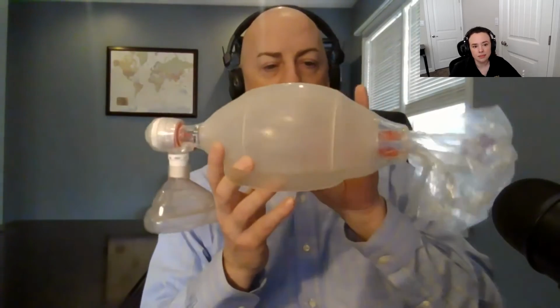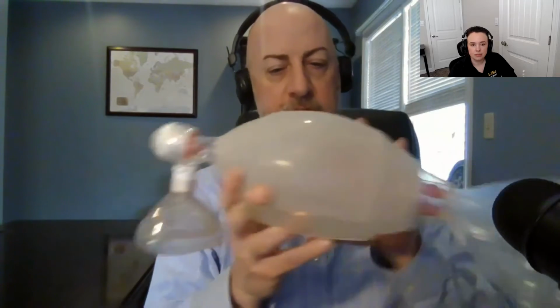So to start us off today, can you just tell us a little bit about what a BVM is and how it has been used both historically and up until today? Sure. This is a BVM, and it stands for bag valve mask. There's a bag here, and many of them have an extra bag off the end that extra oxygen can go into if you need it. But here's the bag that you squeeze.